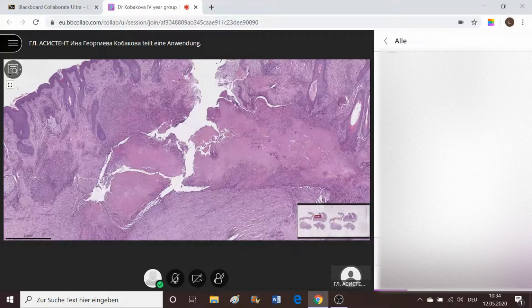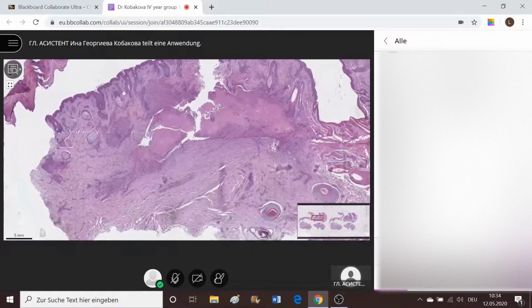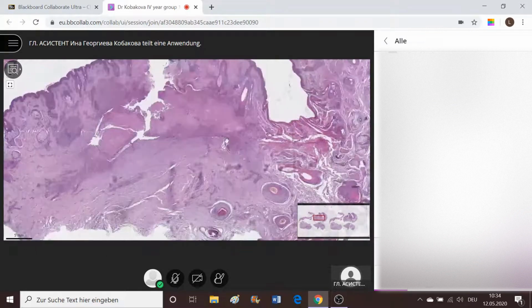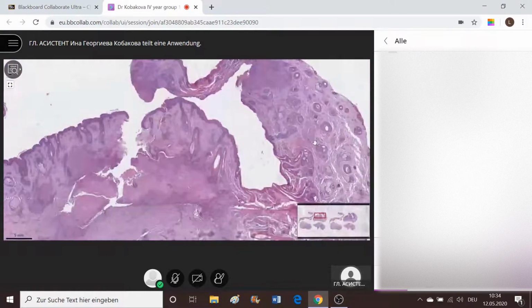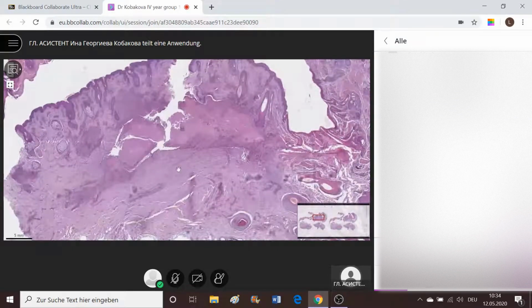The slide itself is named skin tuberculosis. It's interesting by the idea that it has developed in the skin. So what you should mention here is how it reached the skin, which type of primary or secondary tuberculosis that is, how it developed, whether it's hematogenously spread through the blood system, how it reached the dermal layers of the skin.